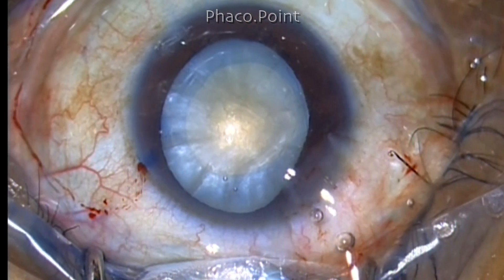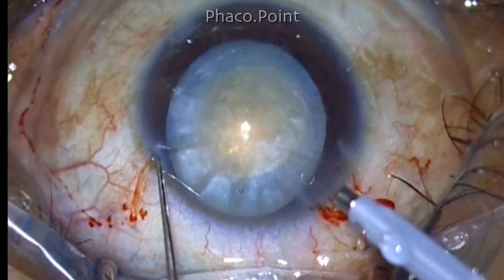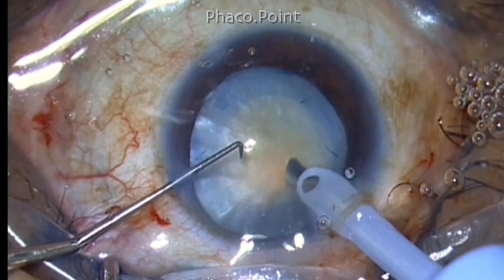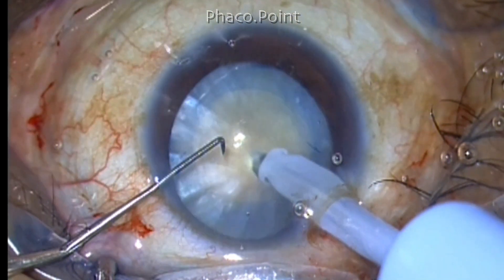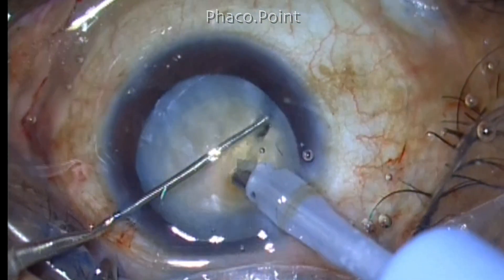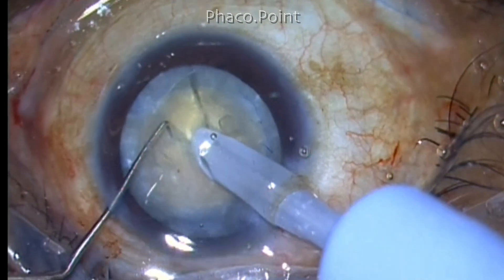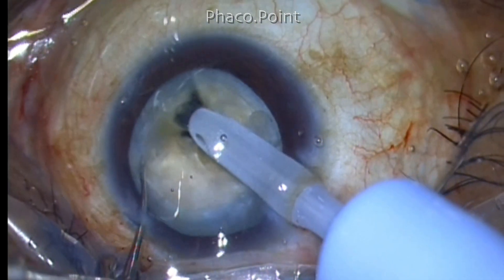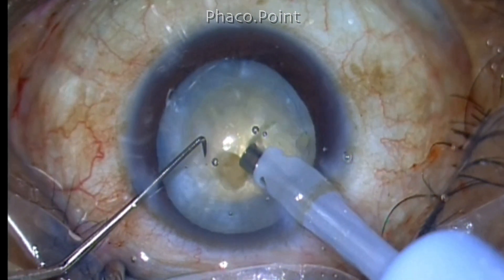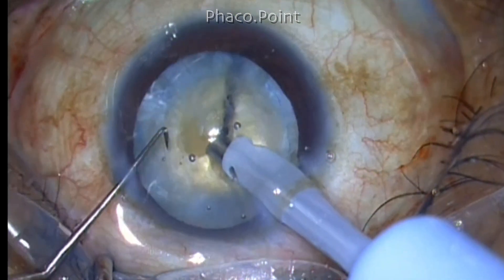In this patient, although the nucleus looks brownish, it is not a very hard cataract and I was able to perform phacoemulsification using a power setting of just 40%. In a bevel-down position you get instant occlusion, then you bury the tip. As you bury the tip you rotate so that the bevel goes anteriorly. This is like a small screwdriver motion that you make as you drive the phaco probe into the nucleus substance. Once you've gone to sufficient depth — because the lens is not really hard but rather chalky because of the young age of the patient — it's quite easy to create the lateral separation and the crack. Before attempting the lateral separation, make sure that the hold on the nucleus is good. It's imperative that you get a very good hold on the nucleus before attempting the crack, and this is ascertained by the depth and the distance to which the phaco probe is buried into the substance of the nucleus.